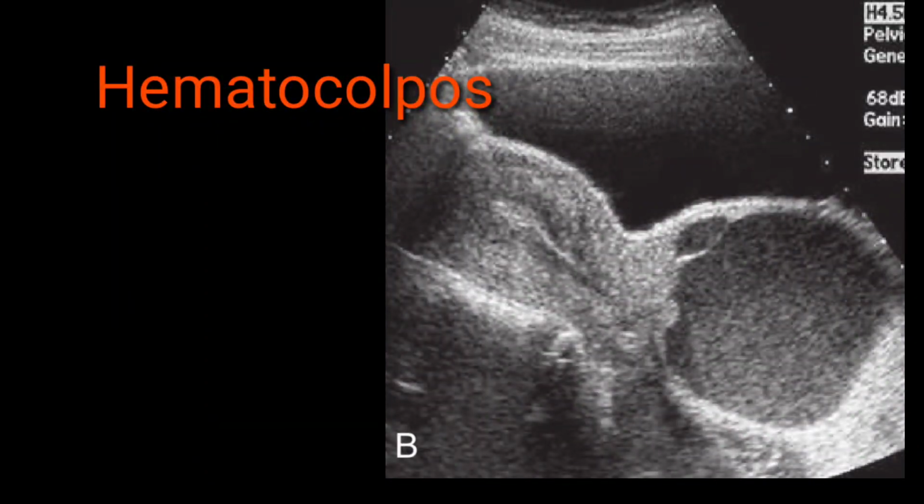So the vaginal canal is distended with low level internal echoes. This is characteristic of blood on ultrasound imaging. So this is actually blood. What you need to do is mention that the uterus is okay, the endometrial cavity is clearly visible, the cervical canal is fine, but down to the cervical canal, within the vaginal canal, a large cystic area can be seen with low level internal echoes. Give the measurement.